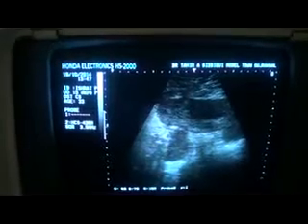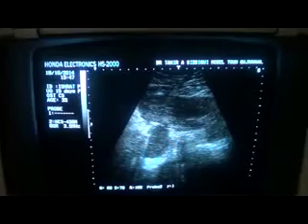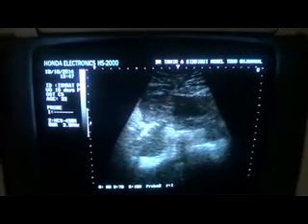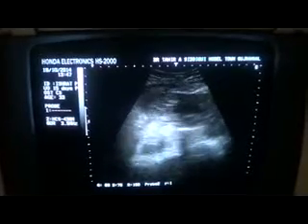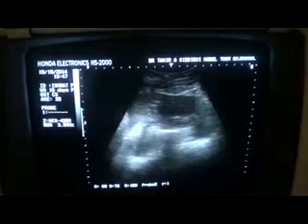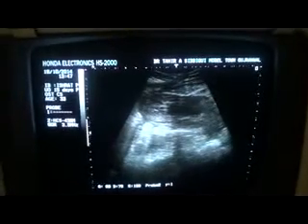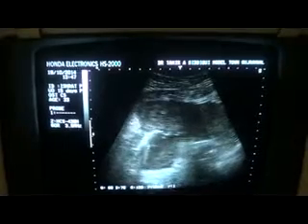This ultrasound study pertains to a female aged 33 years who had a cesarean section 15 days back. Since then she has had fever with rigors. She is on antibiotics.